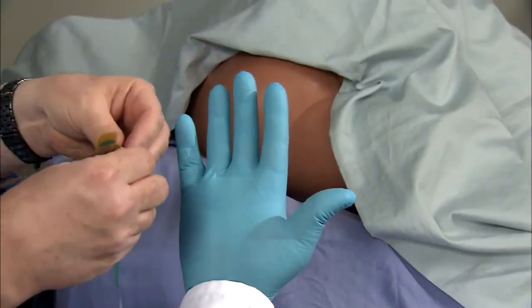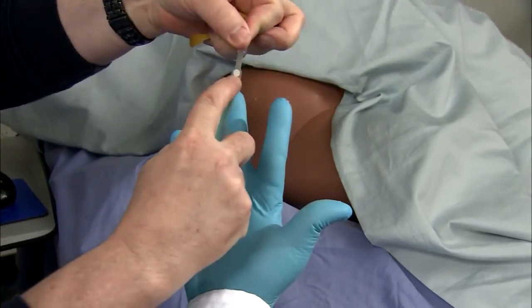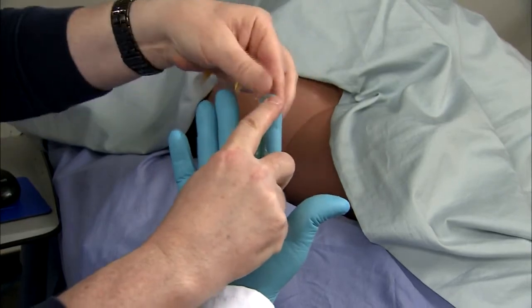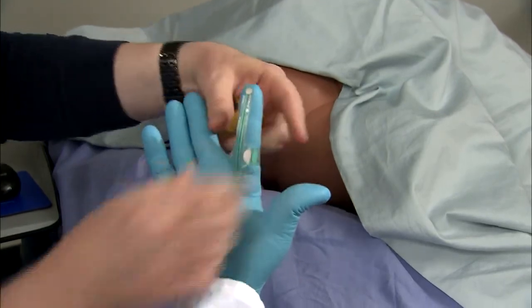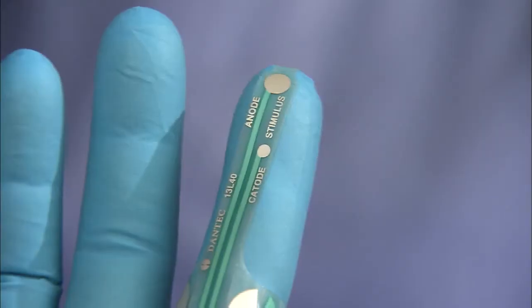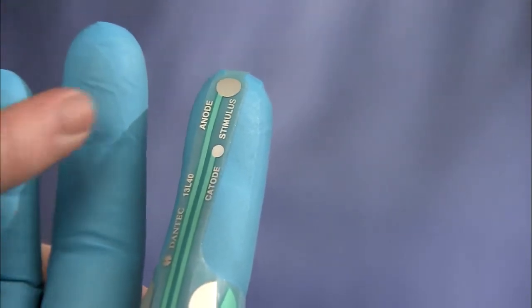The St. Mark's electrode is applied to the physician's glove. It is real important that this little dot is on the glove, on the surface of the finger there, where he'll be touching the nerve. And then these electrodes here are placed around the finger. This is the proper attachment of the St. Mark's electrode to the physician's glove.